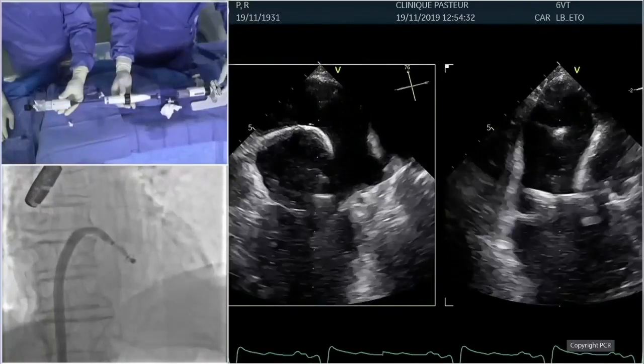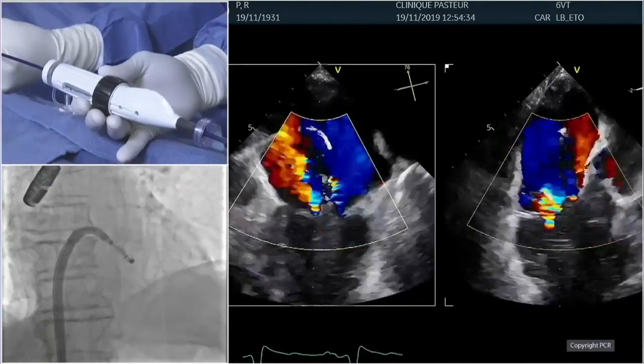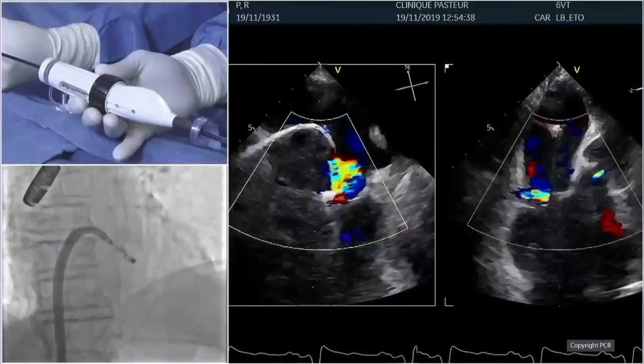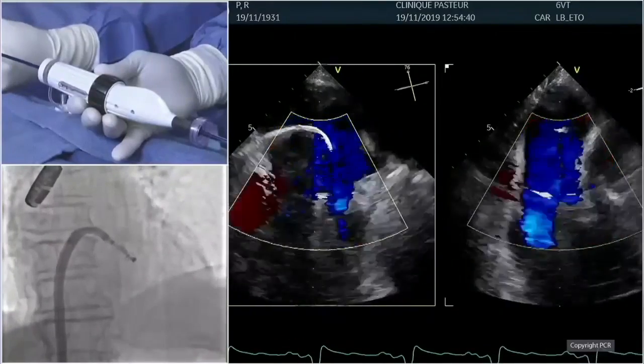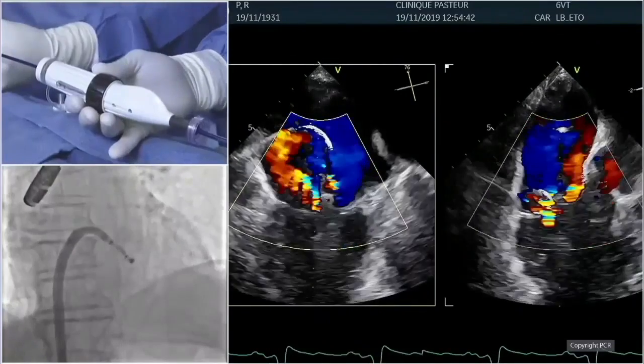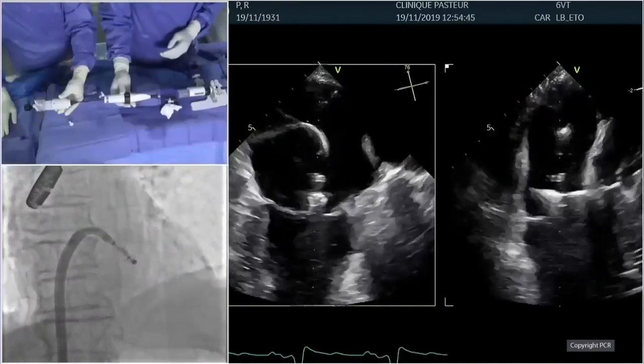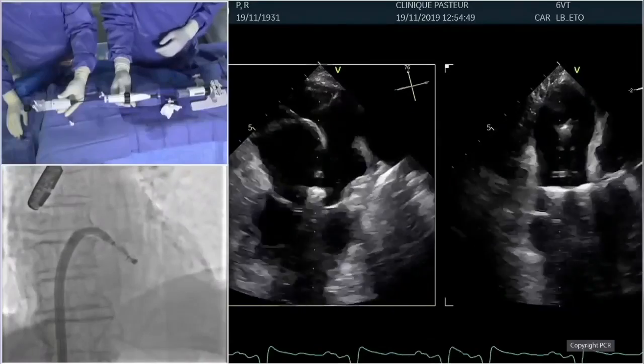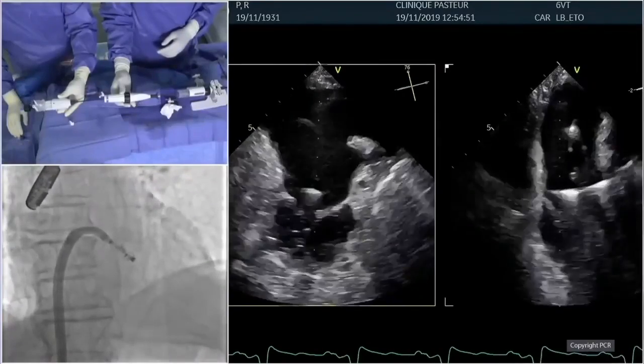Okay, color, Laurent. Okay. So on color, it's good. It's good, yeah. Okay, you can skip the color. On peut enlever la couleur. And now I think we can focus on the LVOT. Yeah, focus on the LVOT. And dive into the left ventricle.